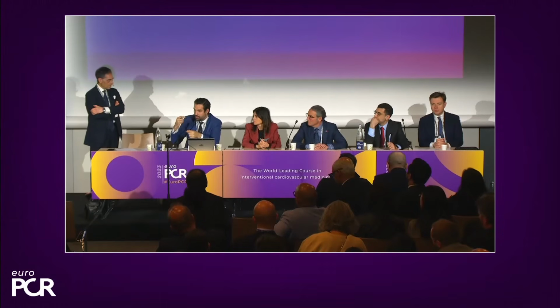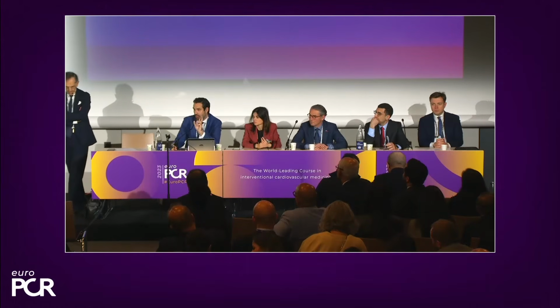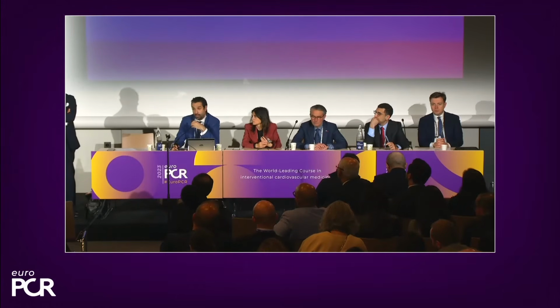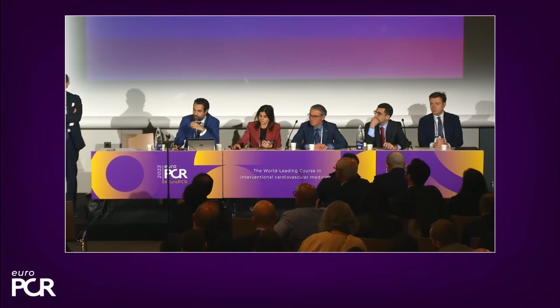And this is going to be the validation that we would like to do to understand what is the capacity of this technology, to look at arc, to look at thickness, and to look at length. These are the three elements. So I think it's too early to say that this tool is going to be fantastic to assess calcium, but the potential is huge, and we're certainly moving in that direction.